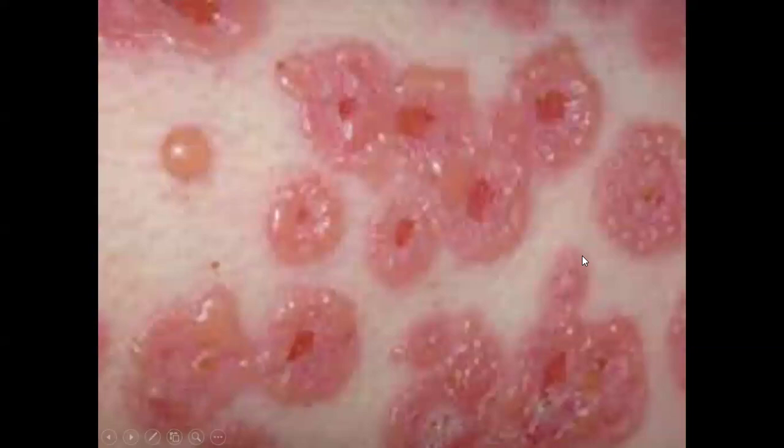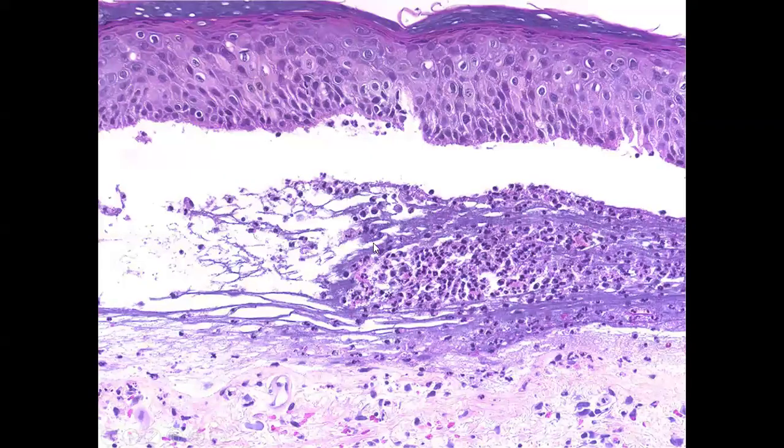So again, we see a tense blister in this picture, but here you can appreciate that blistering is in annular fashion, like we saw the superficial vesicles in IgA pemphigus. So this is linear IgA disease. Here, the blistering is subepidermal, but the inflammatory infiltrate is mainly neutrophils and not eosinophils. You can see this in children, and that is called CBDC, but the histopathological appearance is similar to linear IgA disease. So this is the linear IgA disease.